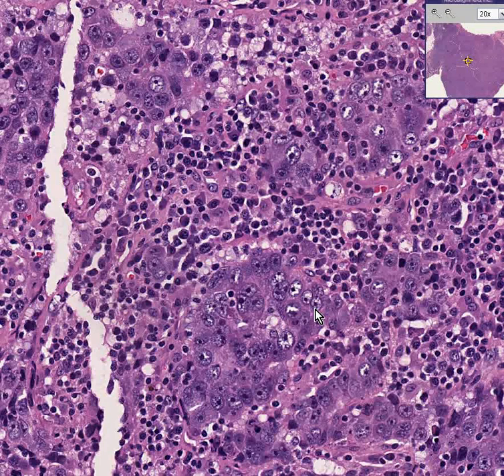better than normal. Or perhaps you want to go back to what your eyes saw grossly, in that it seemed to be very well delineated and not infiltrating too much. But statistically, these do better than the run-of-the-mill infiltrating ductals, just like the colloid carcinomas do better as well. Medullary carcinoma of the breast.